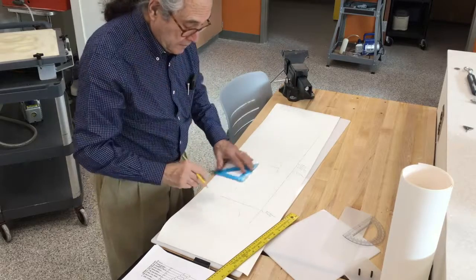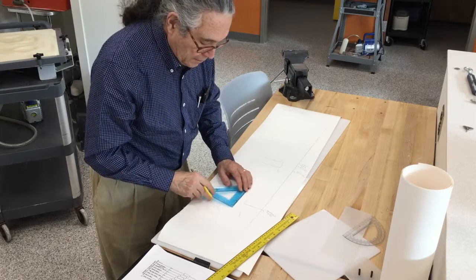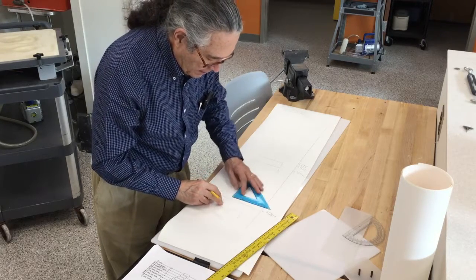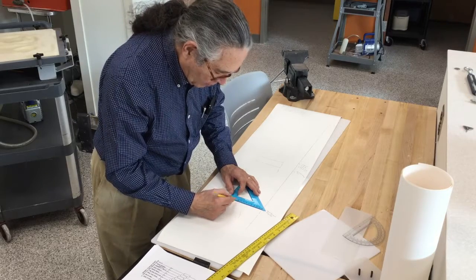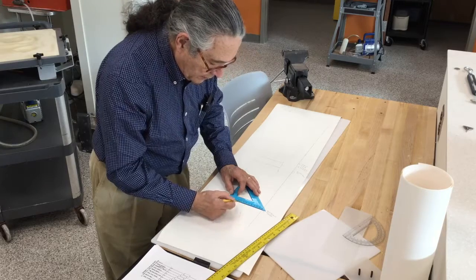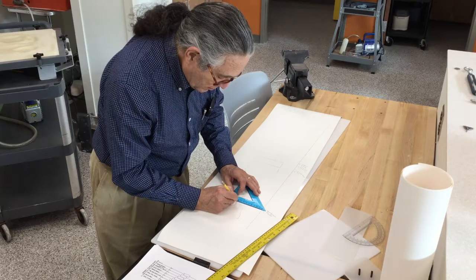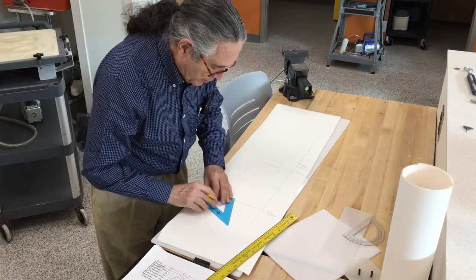With this done, we want to establish a mid-ankle line. We do that by measuring the outline of the ankle, which is 56 millimeters. Half of that is 28 millimeters, and we drop a perpendicular.